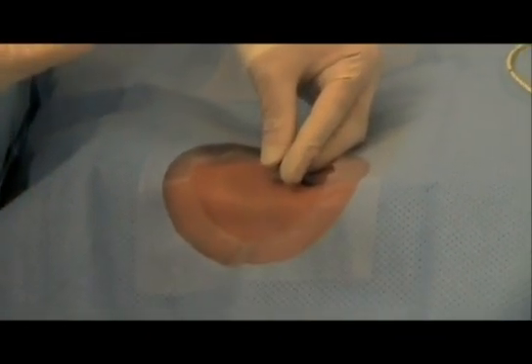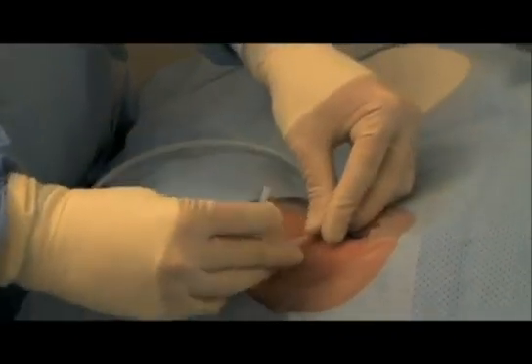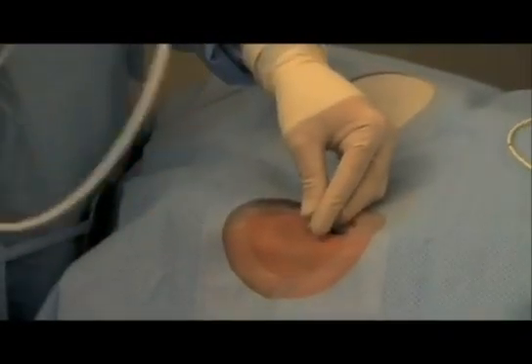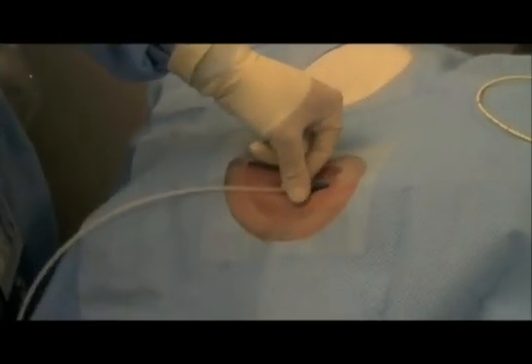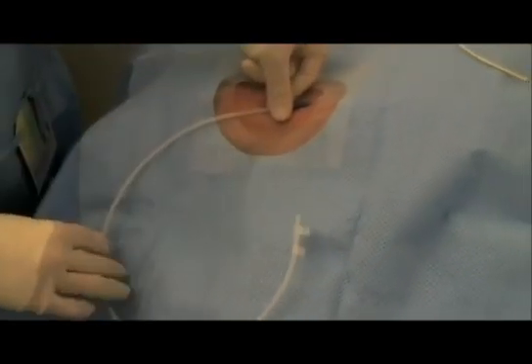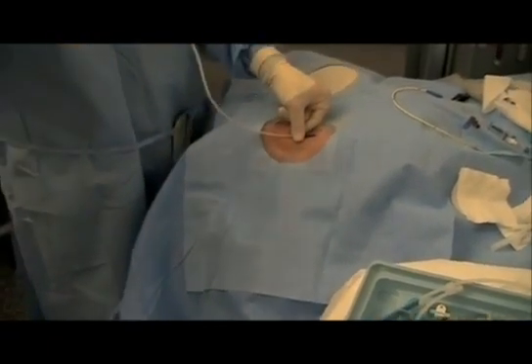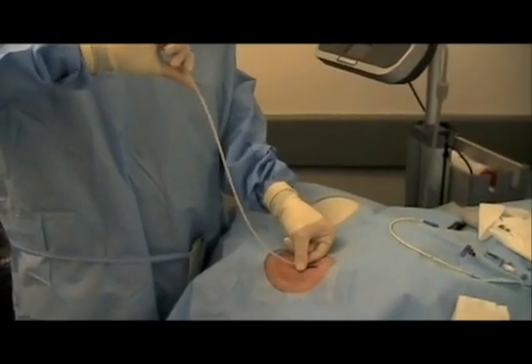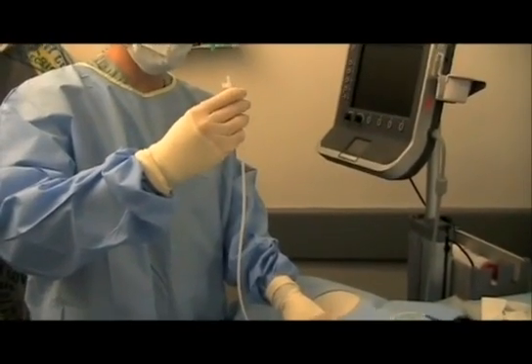Have a nurse hand you an extension set. If you don't have a nurse available — and this is a tip recommended by Michelle Lin, who I think is on the west coast — you can even take the sheath the wire came in. You're going to attach it to your angiocath and fill it up with blood, whether venous or arterial, until about 25 centimeters. Then you're actually going to hold it up and you'll have a level of blood. If that level keeps spraying up through the top, you're in an artery, because this is way higher than the patient's central venous pressure should be.